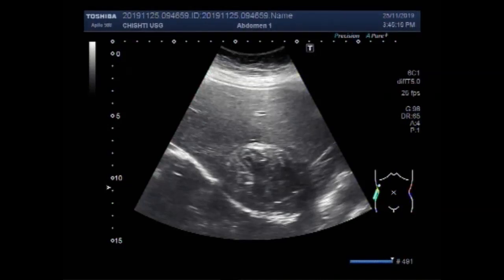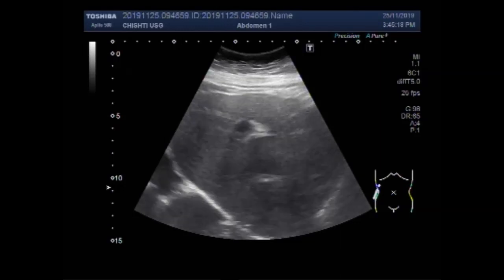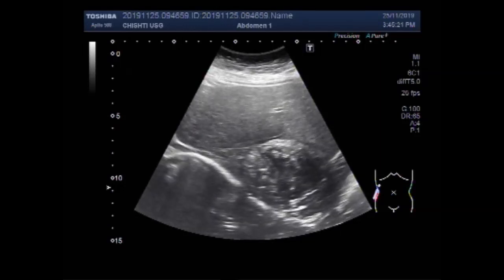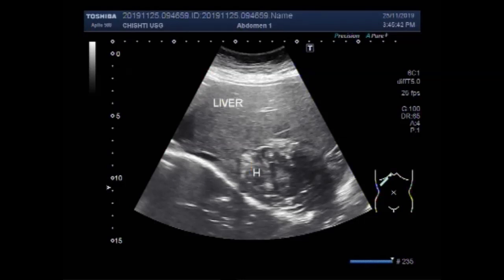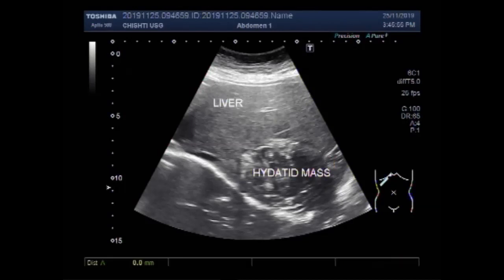Dear viewers, I hope you are all fine. This ultrasound video shows a large hepatic hydatid mass in the lower portion of the liver, in the area between the right and left lobe. This is the liver, and this is the hydatid mass. It measures about 6.8 centimeters by 4.9 centimeters.